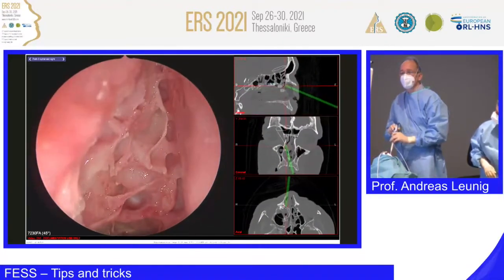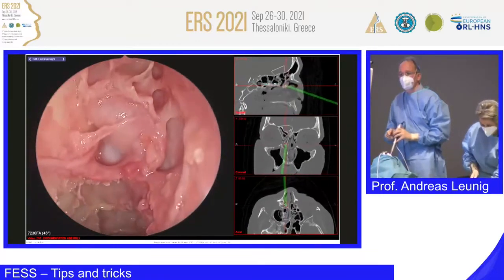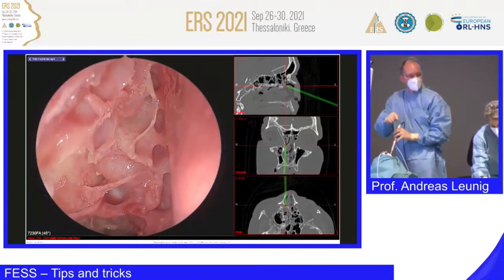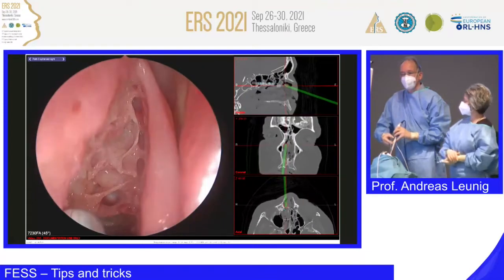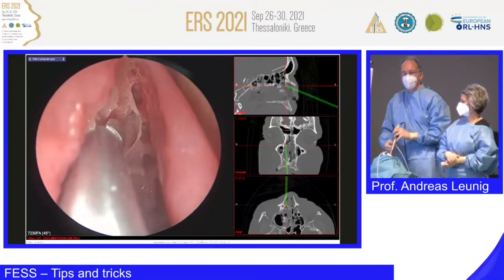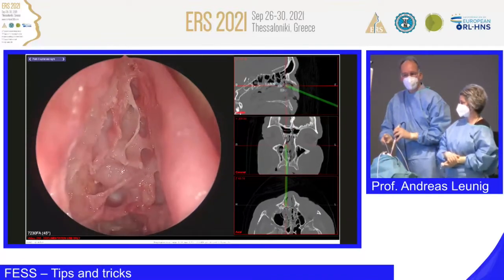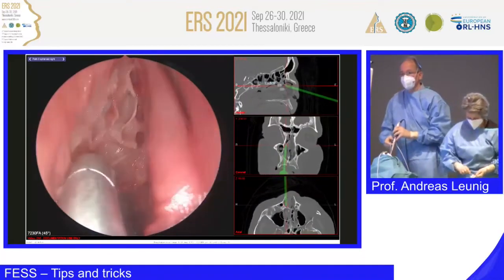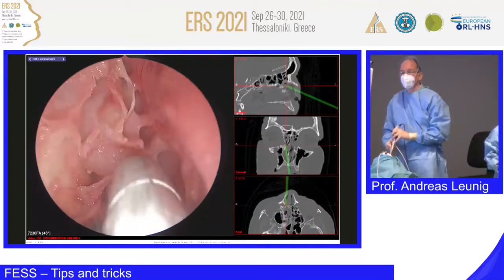Excuse me. Yes? Hello, I'm Tim Terzis. May I ask a question? Yes. Talking about mucosa preservation, what would you think about using powered instrumentation? Yes, which would preserve mucosa. Yes, thank you very much. I mean, when we're talking about preserving mucosa, we are not talking about nasal polyps. I think nasal polyps should be removed either medically or surgically. And this is still the treatment of choice. And I love the shaver, especially for this. And you're definitely true. And maybe we can show the shaver. We can bring it in place, and now I try to find the way up into the frontal sinus.